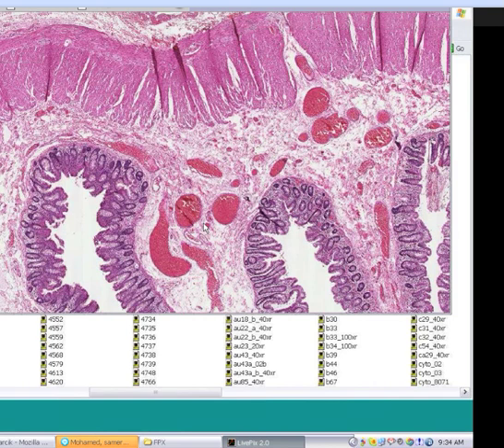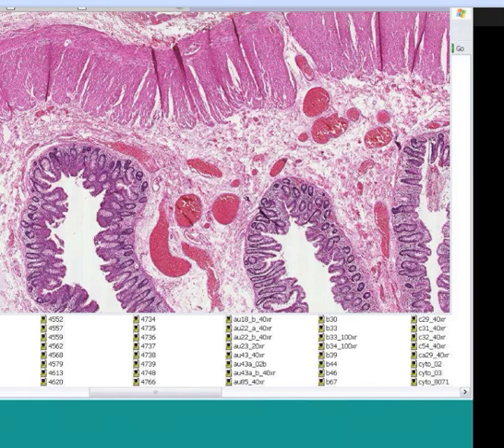And Samer, just from the fact that you said large red, that was a very good observation, because the key diagnostic feature of this particular colon slide is that you have an overabundance of large red things, which are blood vessels, which are an overgrowth of blood vessels, which means this is angiodysplasia. Okay, did everybody get that one?